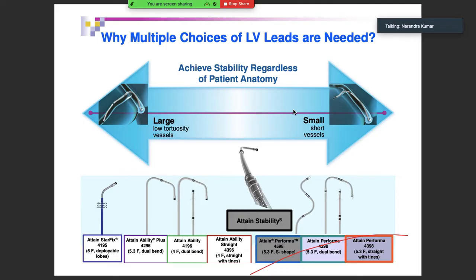patient's age or medical conditions may dictate the particular pacing system, mode of operation, and also the implant procedure which is being used by the physician. The rate responsive modes may be contraindicated in those patients who cannot tolerate the pacing rates above the programmed lower rate. And dual chamber sequential pacing is contraindicated in patients with chronic or persistent supraventricular tachycardia, including the atrial fibrillation or even flutter as well.